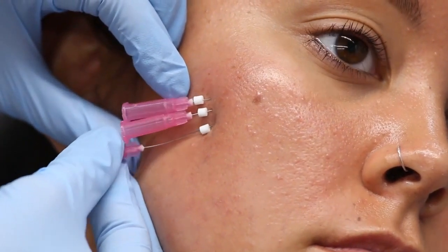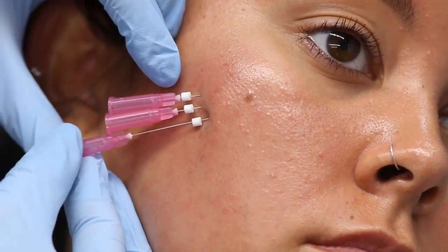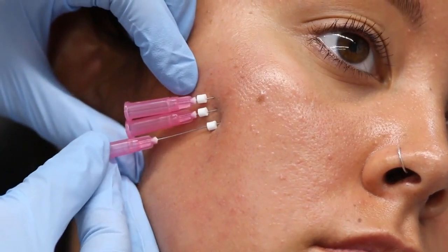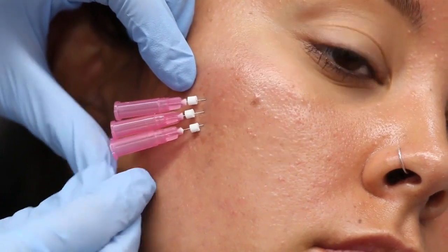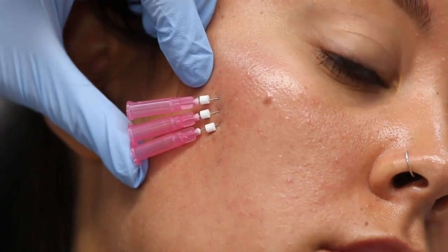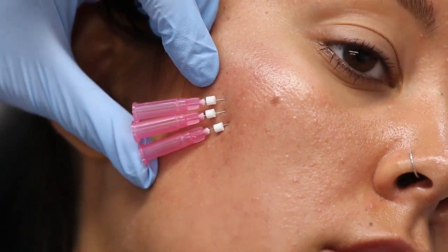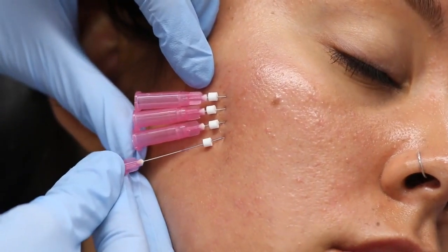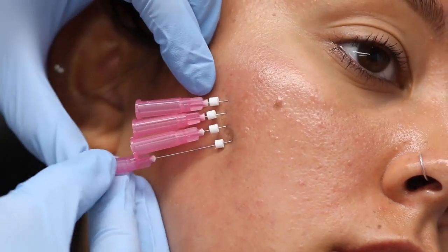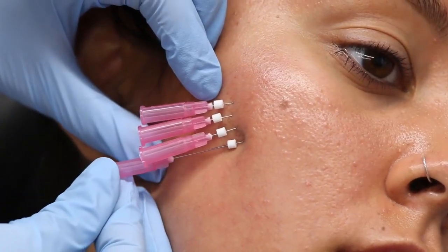And then these threads are designed to go in here, and you can see Ashley placing them. She's going to place kind of like a mesh, as you can see her place these. These are very quick and easy once you learn how to do these. What it requires is great training and knowing where to put these threads, how many threads you're going to put in there.